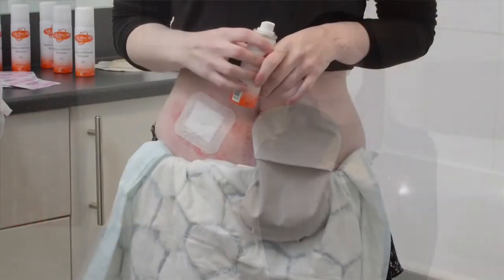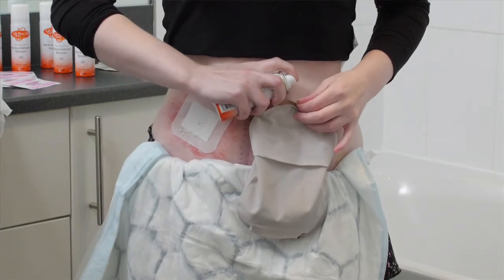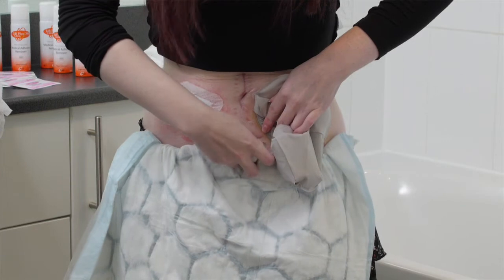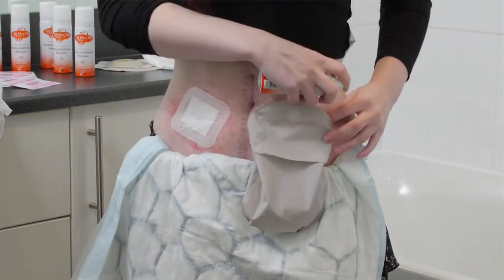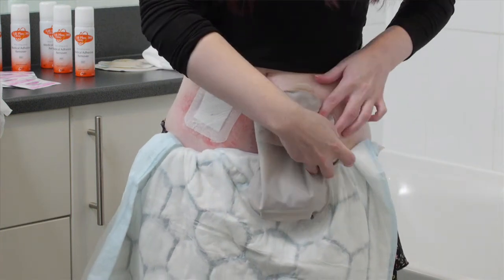To use the product, I'd spray the Lift Plus 360 around the edge of my flange, or base plate — some people call it different names. You can also spray it from all angles, which is good because if part of your bag has adhered really strongly to your skin, it can actually be quite painful to remove.